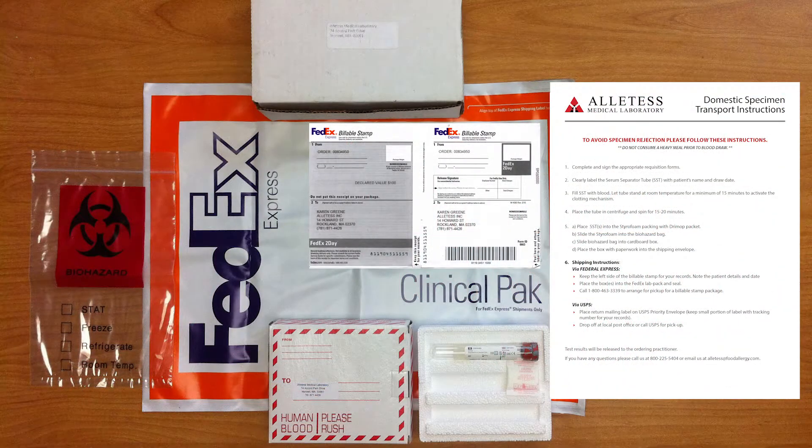The Alletess Test Kit contains all the materials you will need to collect and ship the blood serum sample to Alletess Medical Laboratory.